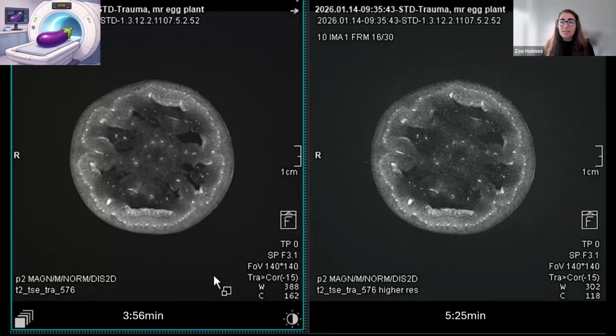So instead of going, oh, I'm just going to increase my resolution, think to yourself, actually, can I just reduce my field of view? Then you'll be able to navigate that issue. Now, if you're going for through plane detail, consider 3D acquisitions when feasible, just because they organically provide thin, continuous slices and they allow you to do reformats as a troubleshooting approach.